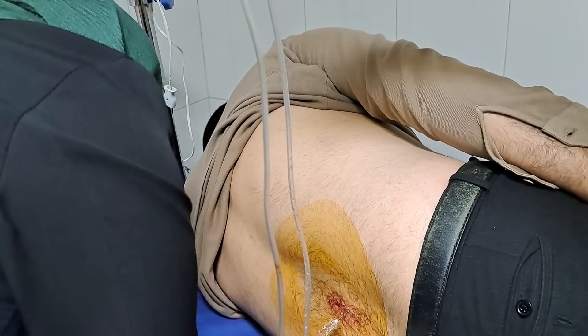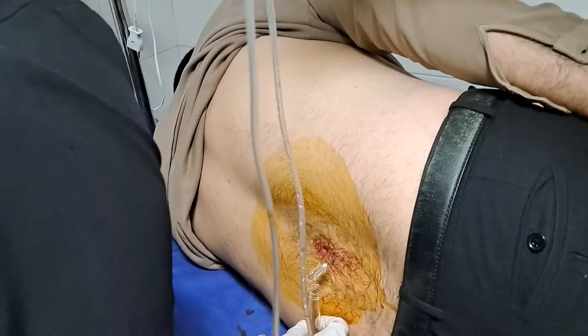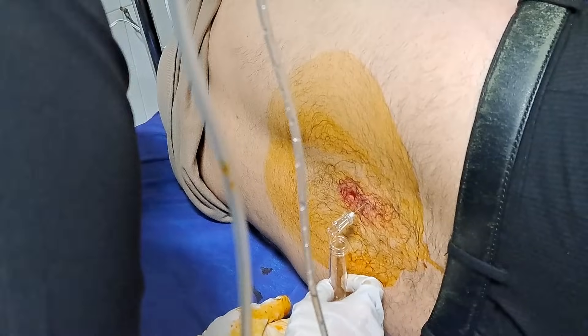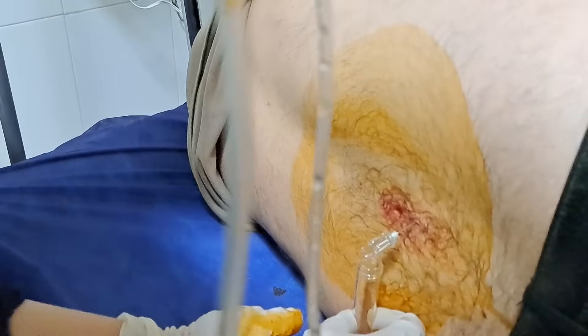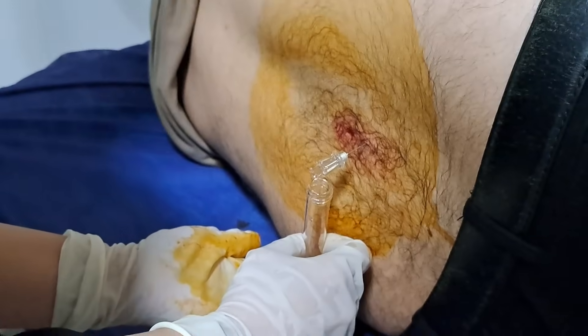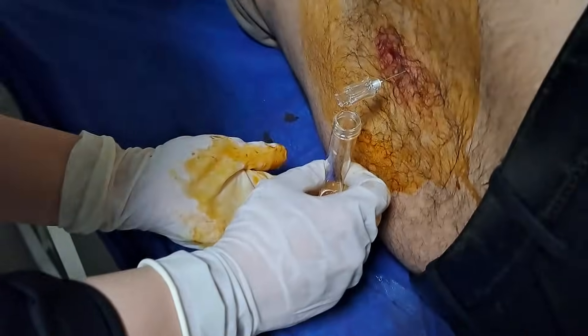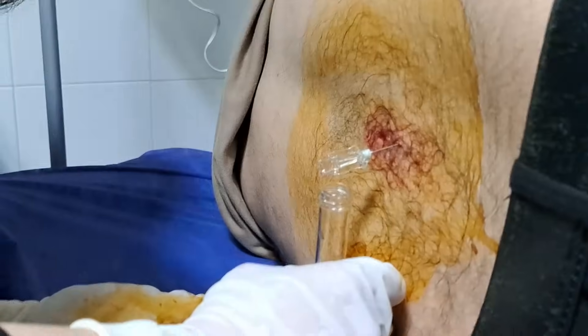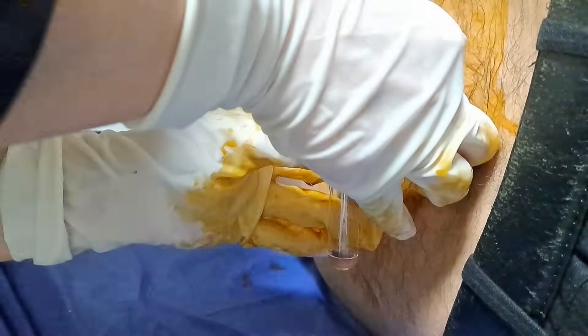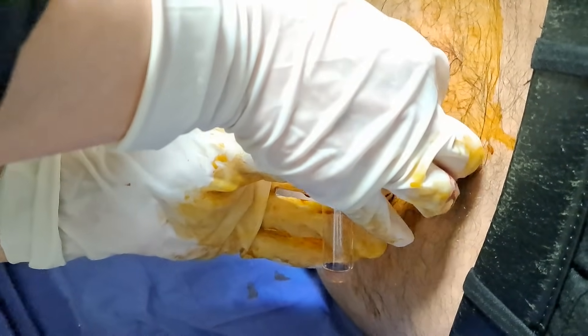Then we collect a small sample of fluid to analyze it to rule out possible diseases. After all this, we ask the patient to take a deep breath while we remove the needle.